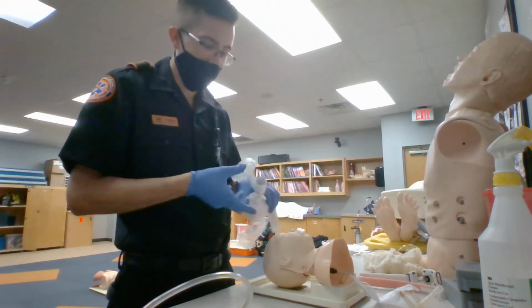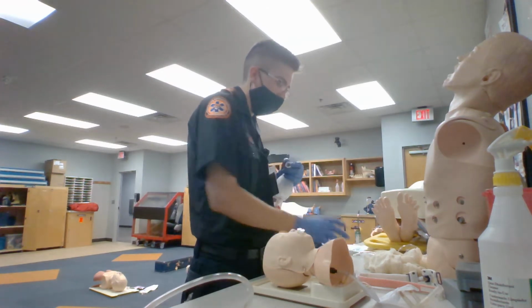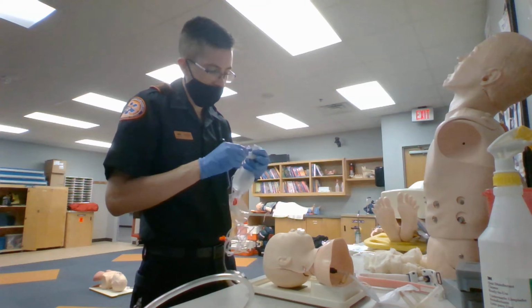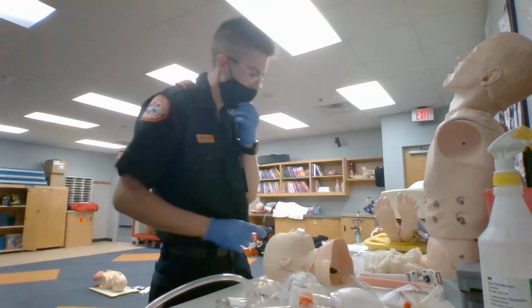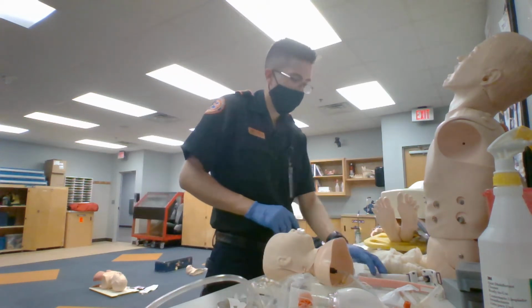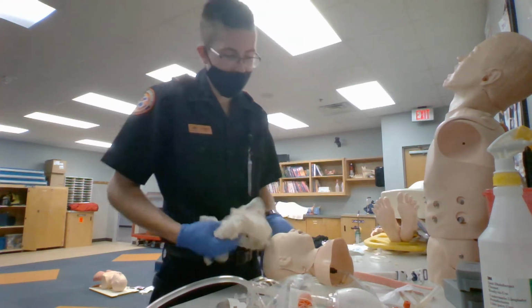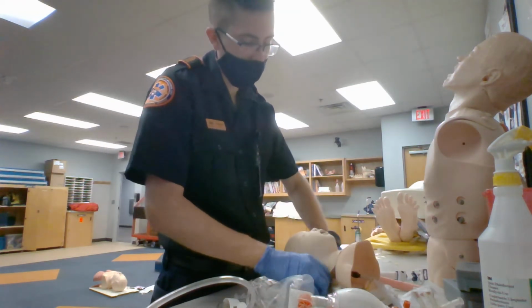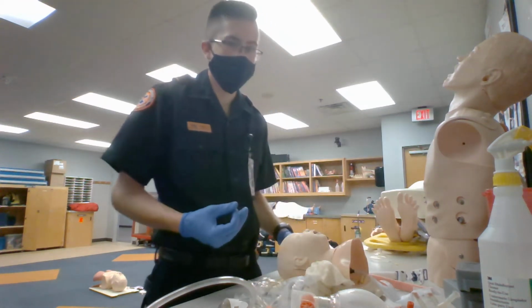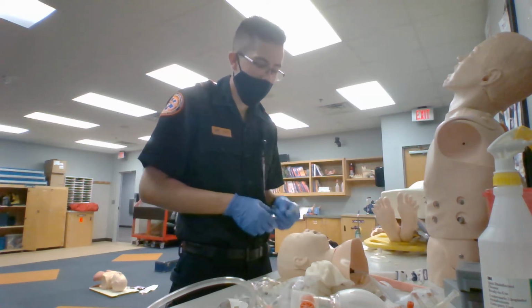So after my patient has been pre-oxygenated, I am going to set up for my intubation attempt. So I will take my BVM, connect it to capnography, find my stylet, my laryngoscope, going to remove my OPA. I'm going to take my padding and pad behind my pediatric in between their scapula to try and get them into a more ear to sternal line.